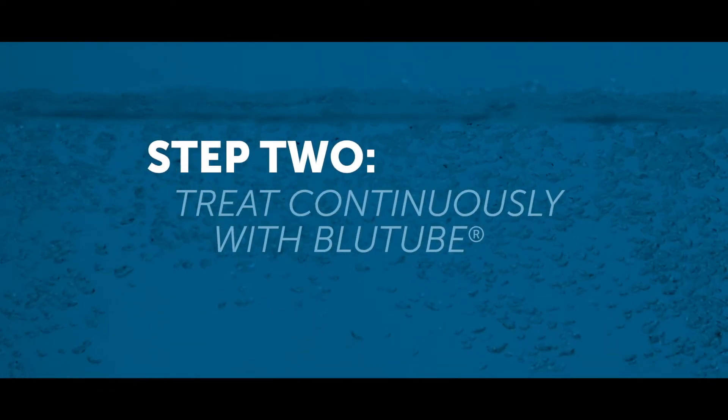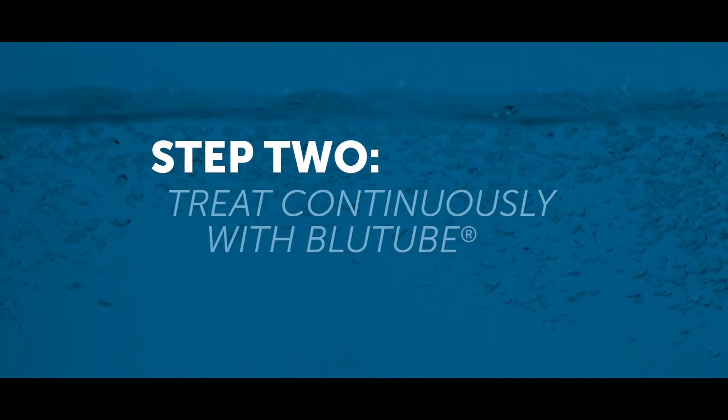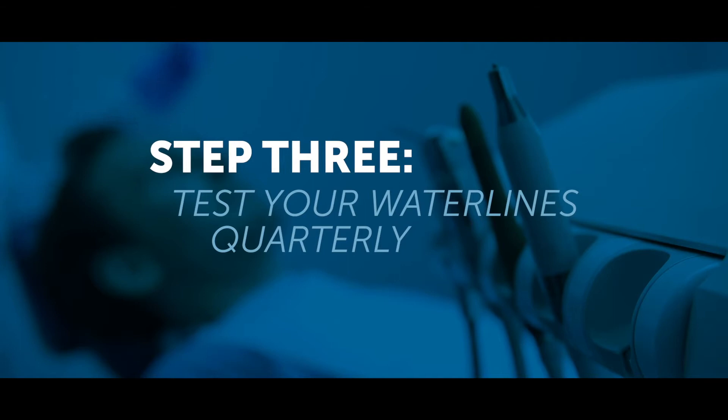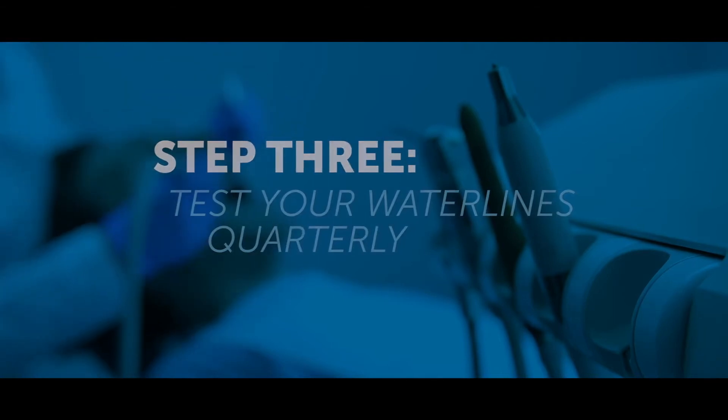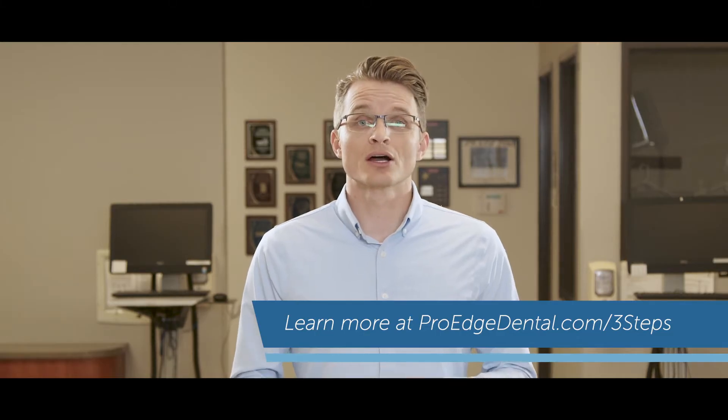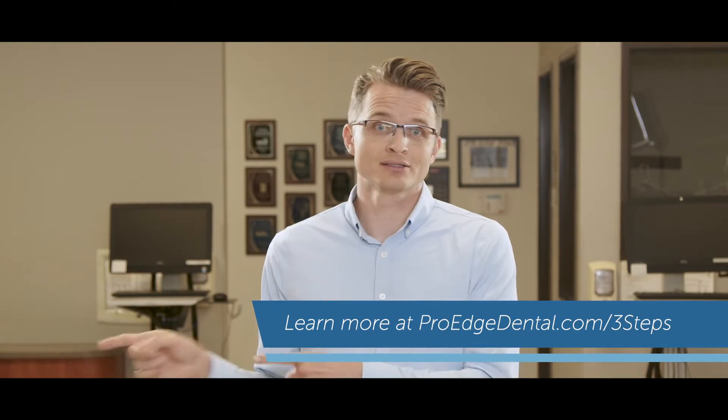Then install blue tube for continuous treatment. And last, that third step: test your water lines at least quarterly to ensure your patients and practice are safe. You can learn more about the three steps to safe water in your blue tube quick start guide or at ProEdgeDental.com/three-steps. Alright, that's enough from Kelly B — here's Kelly T.